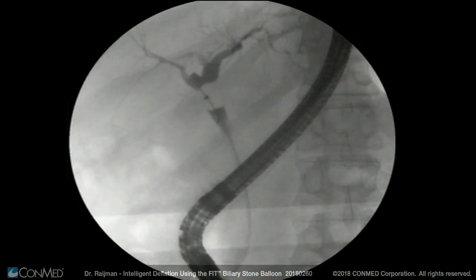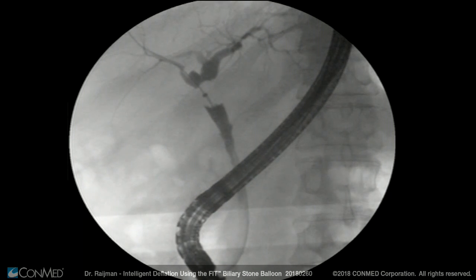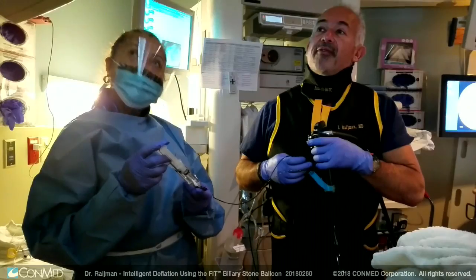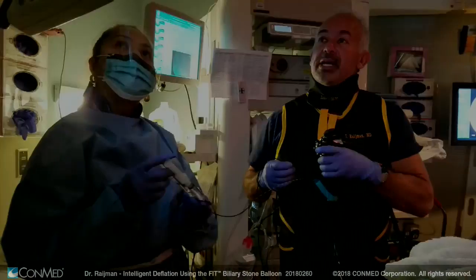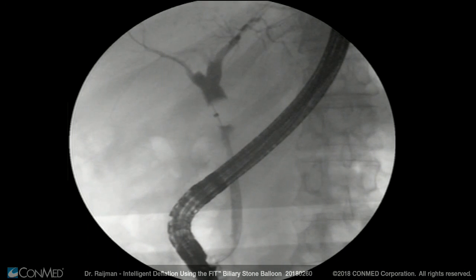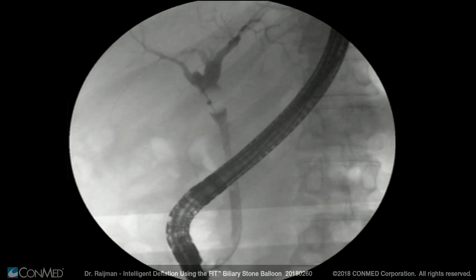By injecting just that small amount, I am not overwhelming the biliary tree, and I can clearly identify the anastomosis and the rest of the distal duct. Now if I were to move the balloon like this, I may be forcing too much of it against the distal duct, which is about half the caliber — if not less — compared to the biliary tree above the anastomosis.